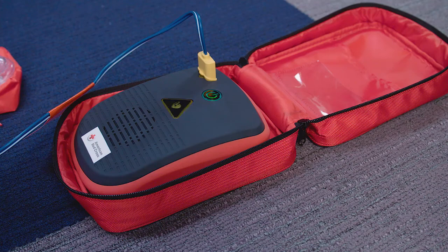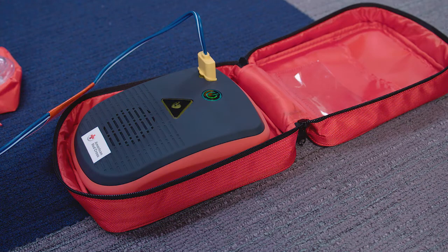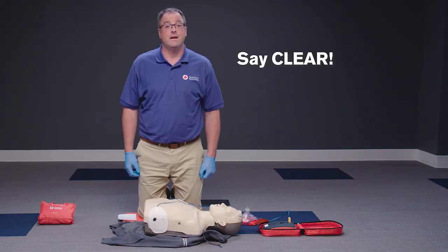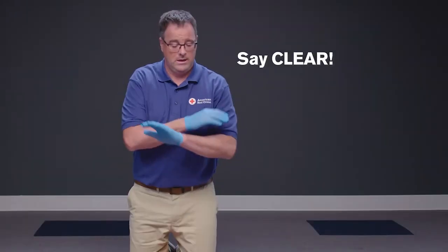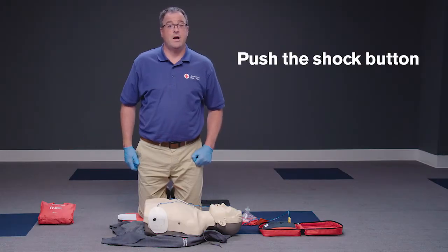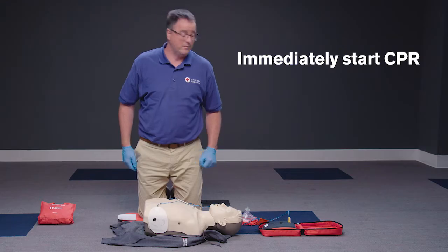When the AED indicates a shock is advised and prompts you to press the flashing shock button, again make sure no one, including you, is touching the person and say "clear" in a loud, commanding voice. Push the shock button to deliver a shock, and immediately start CPR beginning with compressions.